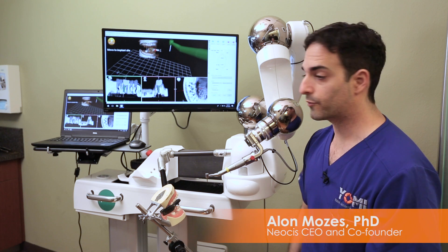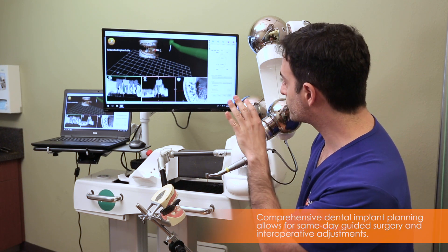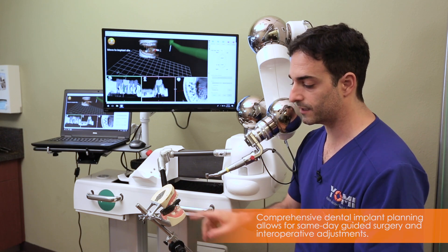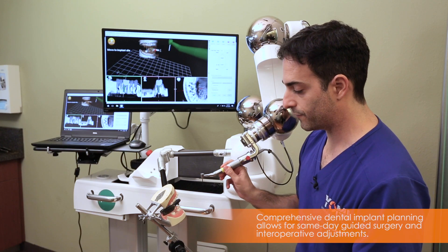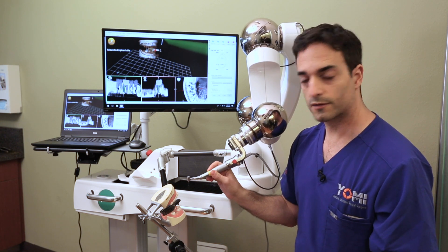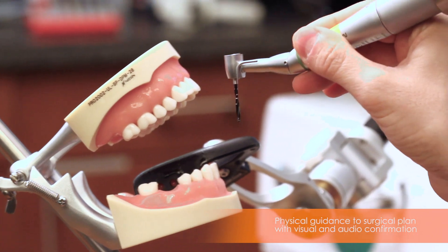Here we have Yomi prepared for surgery. We have planned the case — an implant in the lower right, number 30. The extraction has already been done. At this point, the robot arm is in guided mode, so it's free to move anywhere when I'm far from the site of surgery.